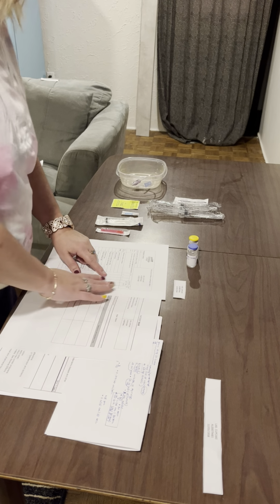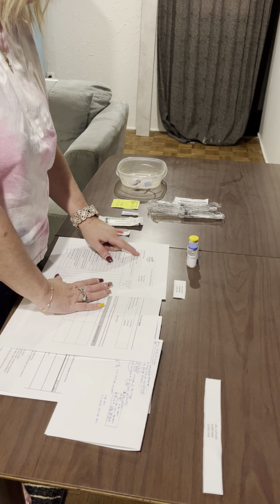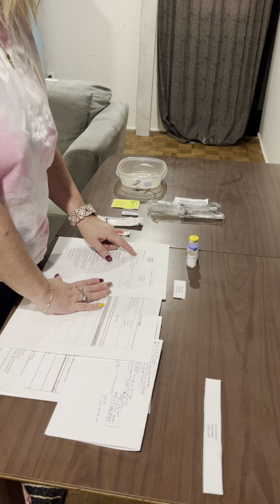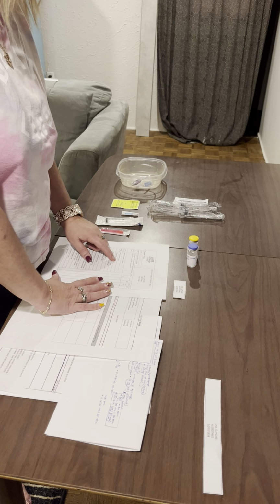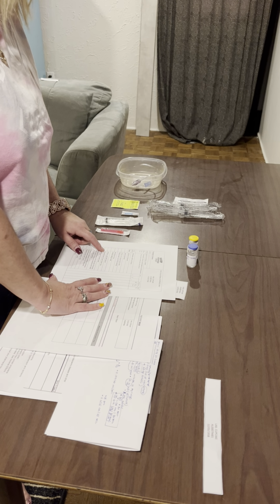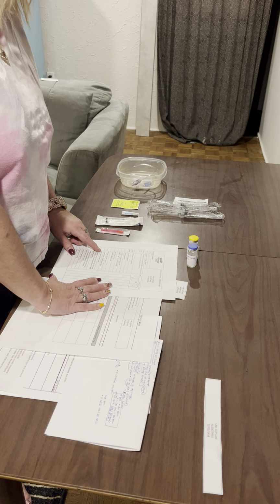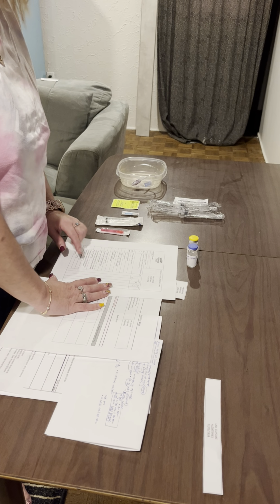We're also going to look to see that this patient has allergies to Cipro, and the reaction is the throat swells. The patient has a diagnosis of query chest infection with a GI bleed. We're also going to go down in the orders and look for the medication we're going to give, which is dimenhydrinate, 25 milligrams, IV direct now. And the order also says to do a saline lock between meds.